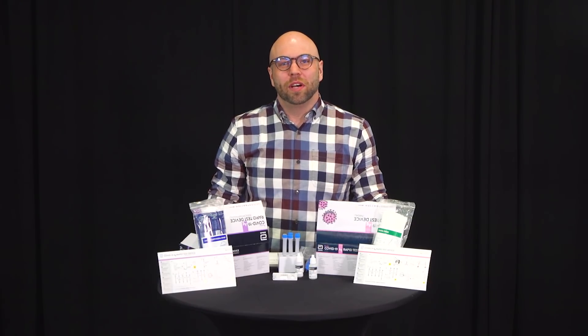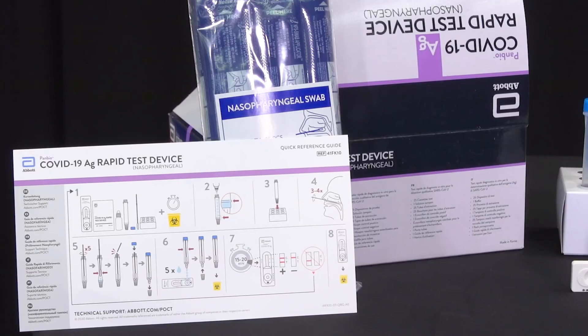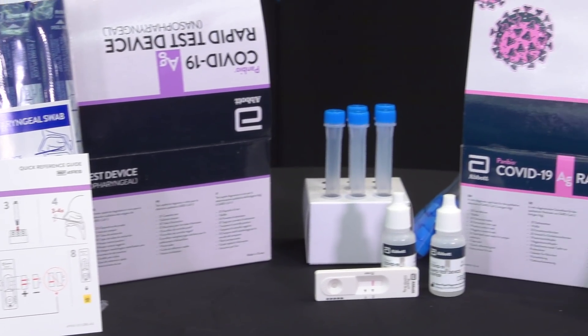Hi, my name is Matthew and I'll be giving you step-by-step instructions on how to perform a rapid antigen screen for each of your employees. I'll be using both the nasal and nasopharyngeal Pan-Bio test.